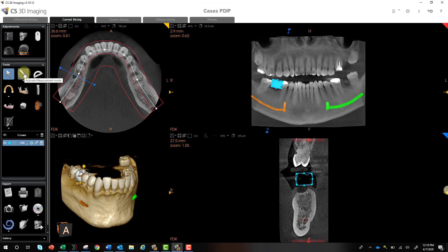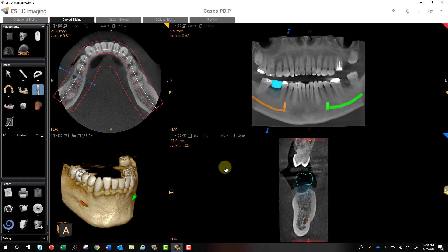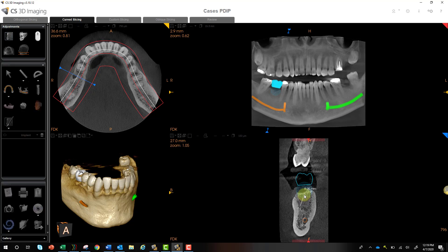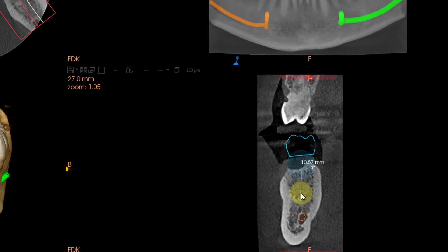You can take measurements like we've already reviewed in previous videos, but the easier way is to just select your implant. You can turn this tutorial off by selecting Do Not Show Again. The implant is currently highlighted and it gives you a little window of where you want to begin taking a length measurement. With one single click, you'll notice that 8 millimeters is actually the shortest distance it's allowing me to measure, because that's the shortest implant in the grouping I have selected as my favorites.